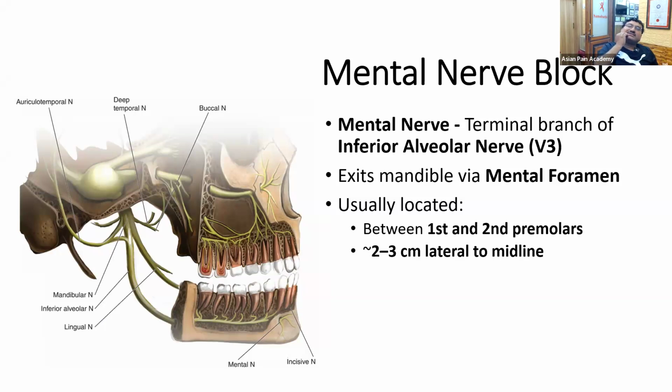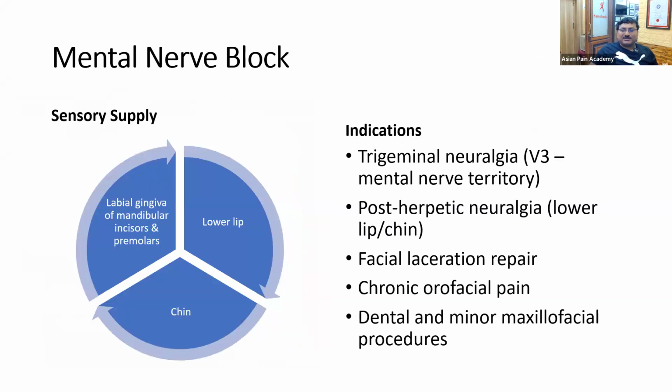So here start scanning from the alveolar process, go a little down, and we will be able to see the mental foramen. Here sometimes it is a little bit difficult to locate the artery, but it is easy to locate the foramen deep within the bone, which is the mental foramen. So in most cases we see the mental foramen. If we are able to see the artery, then it is fine, but even if we do not see the artery, we have to put the drug at this point in the foramen after aspirating, to make sure that we are not injecting into any vessel.